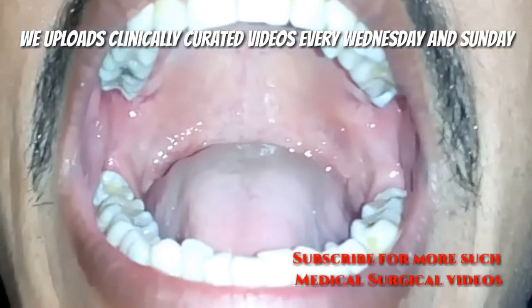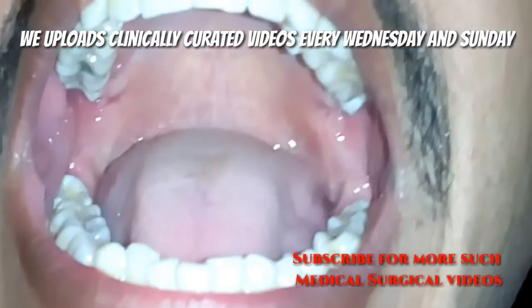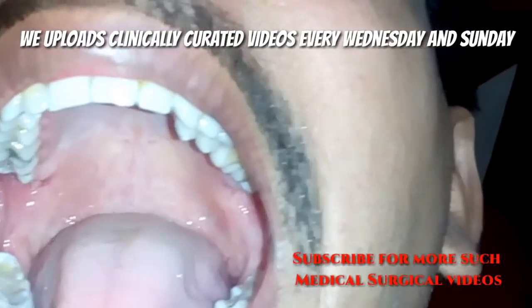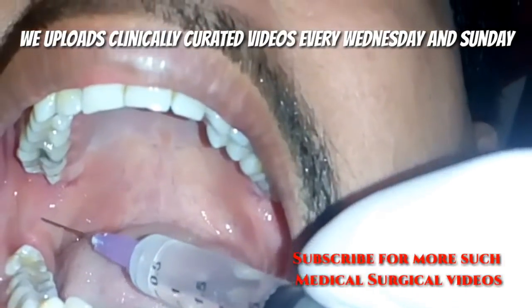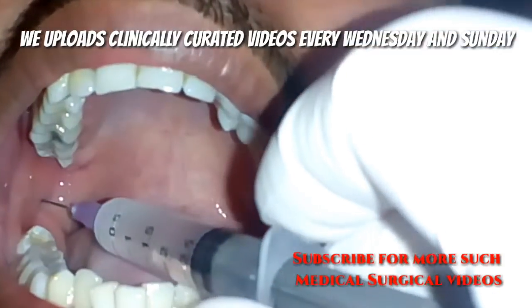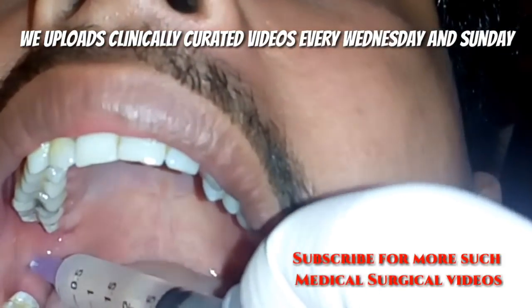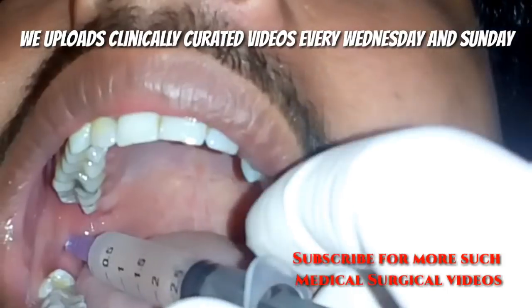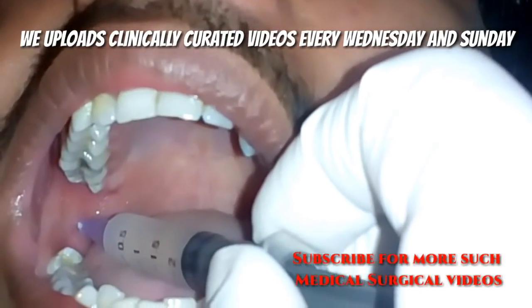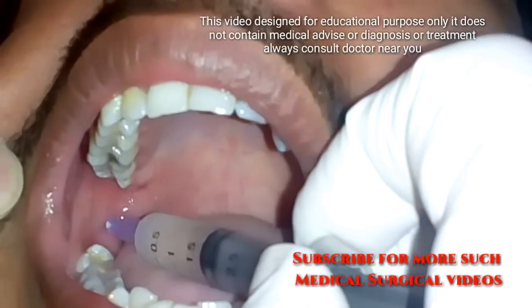In this video, I am showing you how to give an inferior alveolar nerve block to anesthetize the inferior alveolar nerve. This is the most common technique used. The nerve is approached from the opposite side of the mouth, over the contralateral premolars, after piercing the mandibular tissue of the medial border of the mandibular ramus, within the pterygomandibular space.